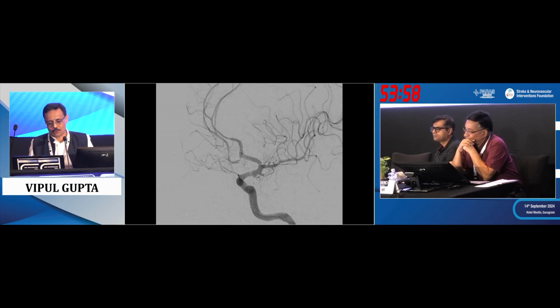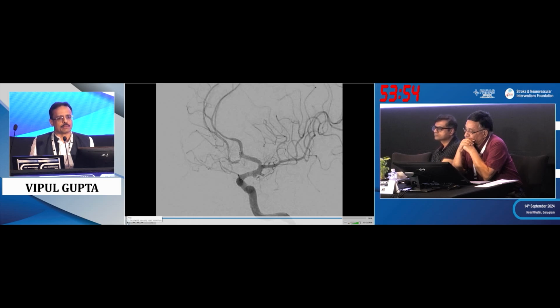Usually we don't see it, we do the shelving technique a lot, but we know acute SAH is a thrombogenic situation. And that's the reason I would absolutely hate to use a flow diverter in acute SAH and a bifurcation aneurysm in acute situation, even with stent.